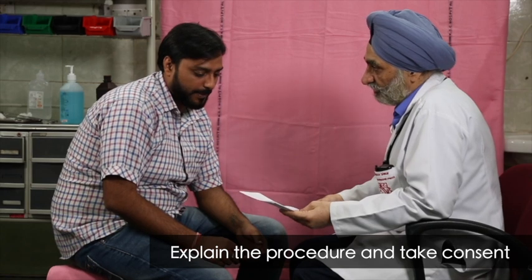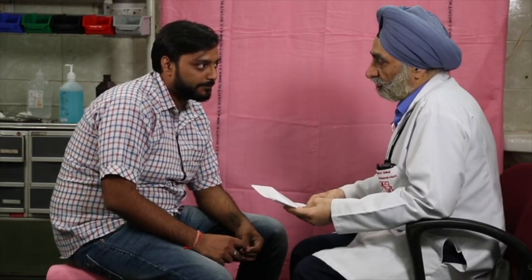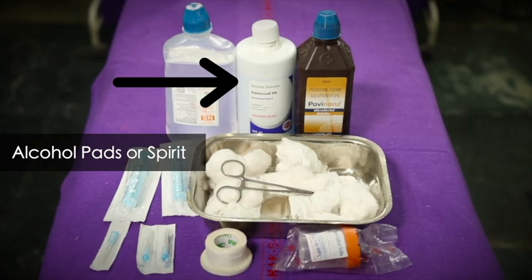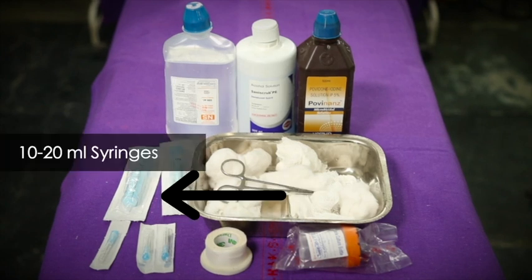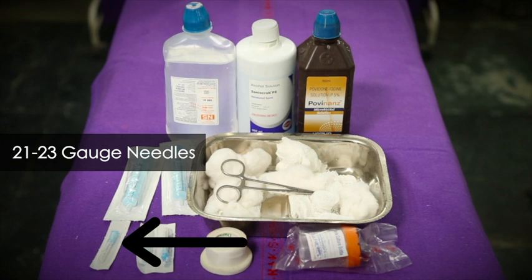To begin with, explain the procedure and take consent from the parent or guardian. Instruments required for the procedure are sterile gloves, alcohol pads or spirit for cleaning, povidone iodine, sterile gauze, 10 to 20 ml syringes, 21 to 23 gauge needles, and a sterile container for aspiration.